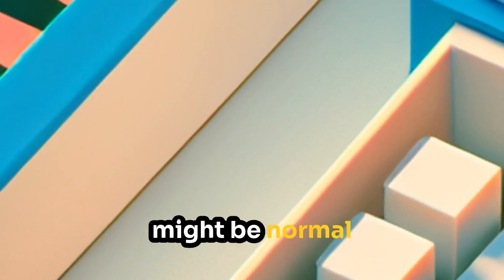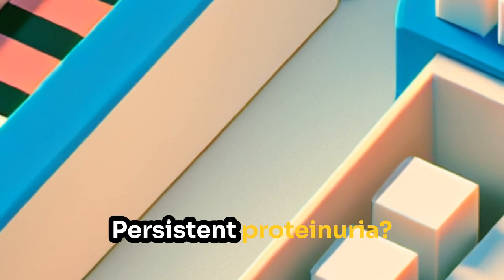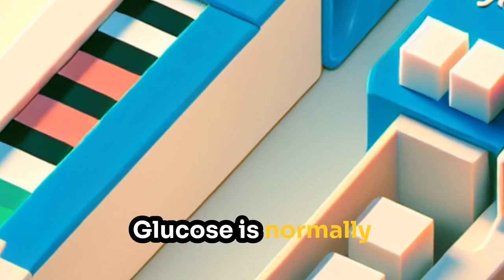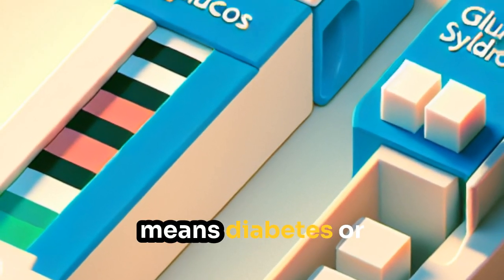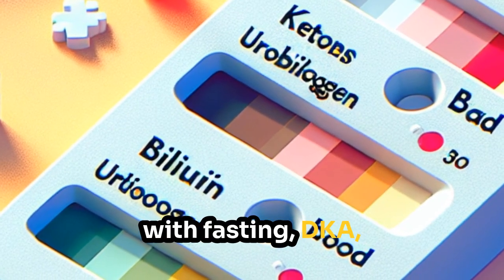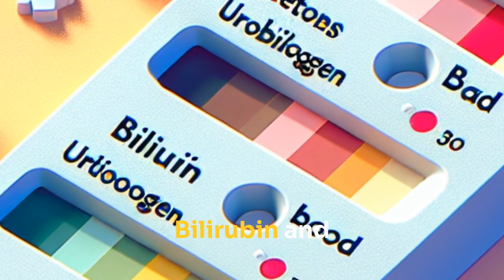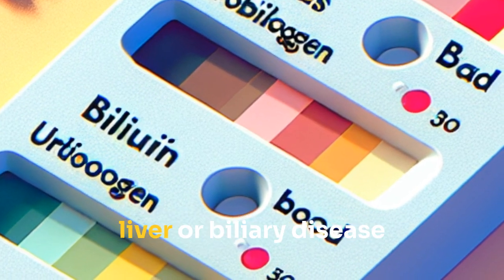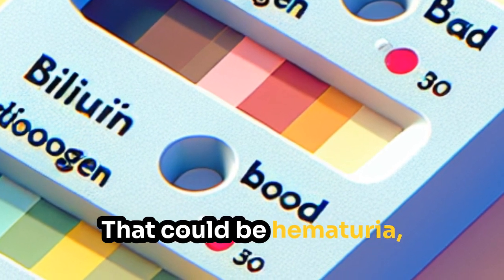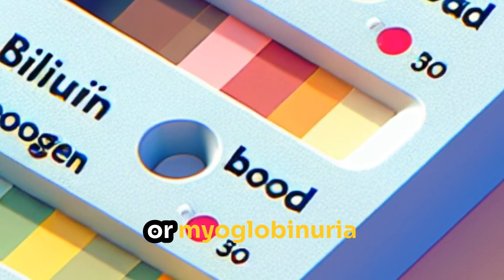Trace protein might be normal. Persistent proteinuria, think nephrotic syndrome or glomerular disease. Glucose is normally absent. Positive means diabetes or stress hyperglycemia. Ketones can appear with fasting, DKA, or ketogenic diets. Bilirubin and urobilinogen suggest liver or biliary disease. Blood on dipstick, that could be hematuria, hemoglobinuria, or myoglobinuria.